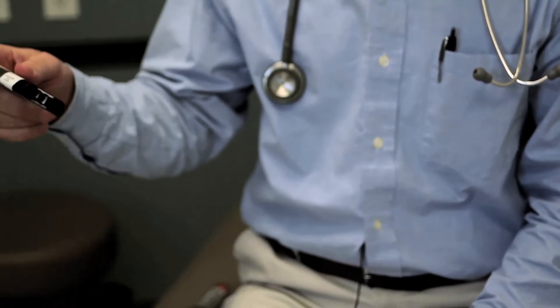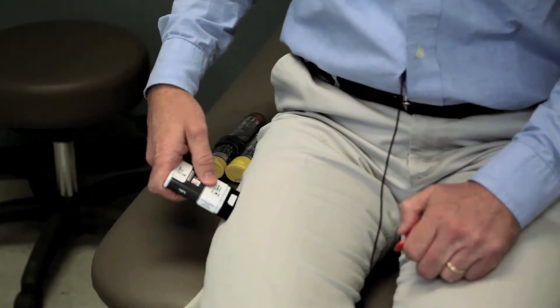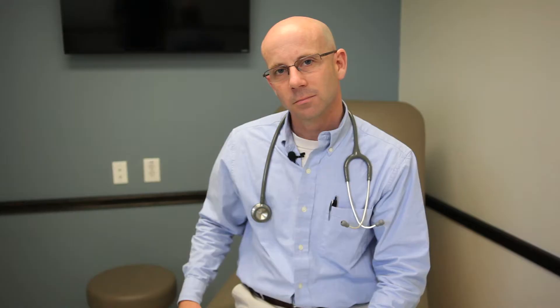This trainer contains no needle or drug. If you are ready to use, pull off red safety guard. To inject, place black end against outer thigh, then press firmly and hold in place for five seconds. [Device counts down: Five, four, three, two, one.] Injection complete.